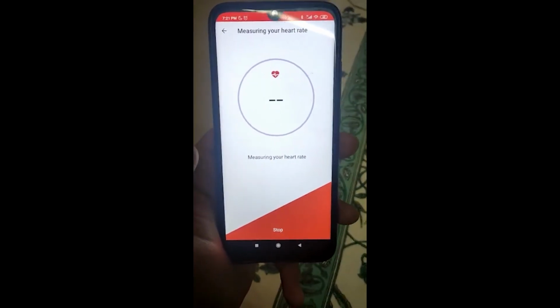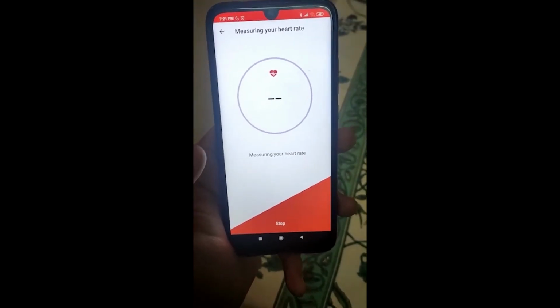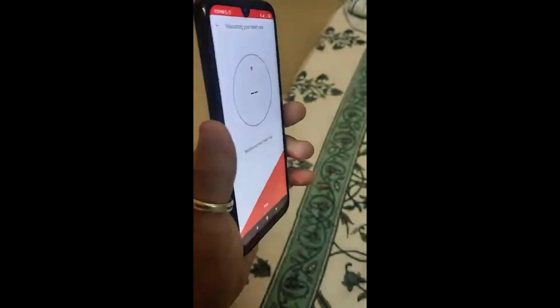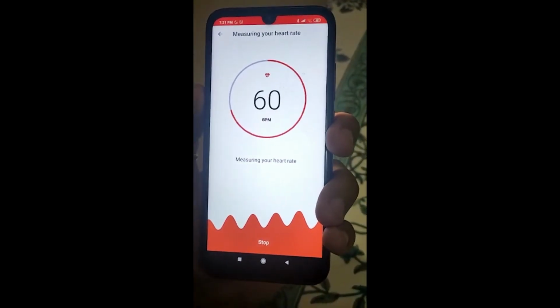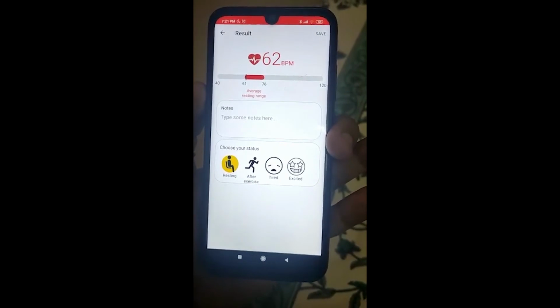At the top we have set the title to measuring your heart rate, and at the bottom we have set it to stop. So this is the layout which we have created in Android Studio, which displays in the app. Whenever we turn on the app, the flashlight turns on automatically, as we can see here. What we have to do is just keep our finger and cover the camera section. As we do that, we can see the beats per minute is calculated accordingly, and the graph is shown at the bottom due to the differences in the increase and decrease of the beats per minute.